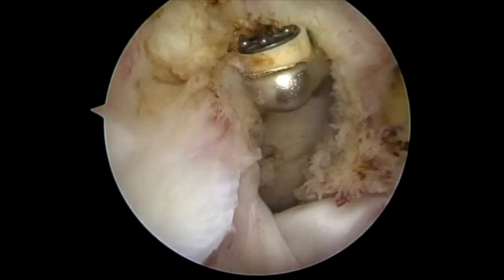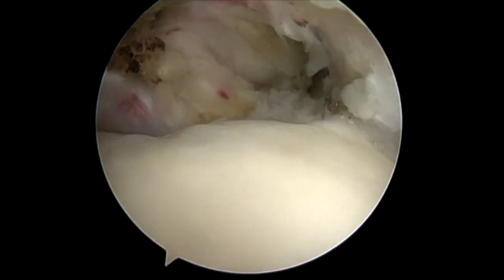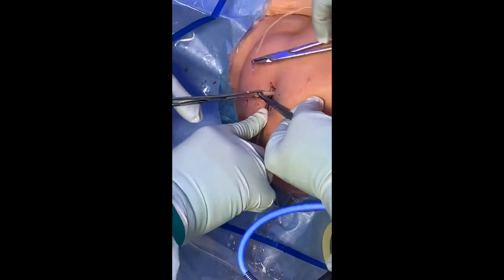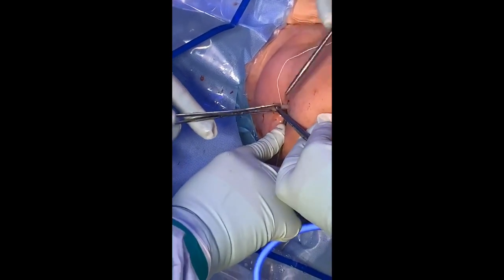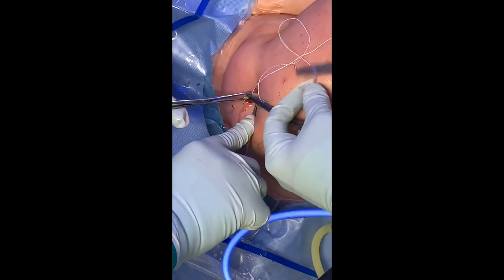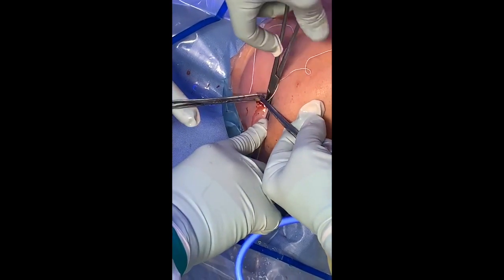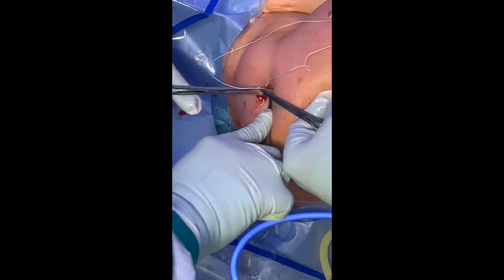We'll switch to the open portion of the video. I grasp the bicep out and pull it with a Kocher. My assistant uses an Alice clamp over my Kocher and uses his Kocher to depress the skin. Even in this patient who is slightly overweight, it's easy to expose the bicep. I perform a locking Krackow-type whip stitch down and back with a number two non-absorbable high tensile strength suture.